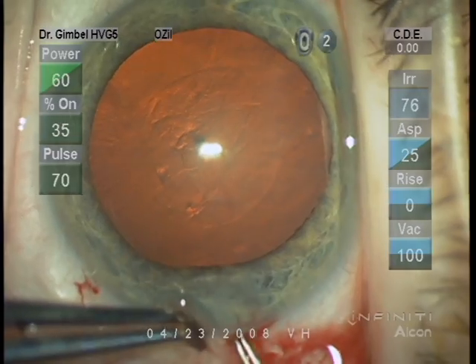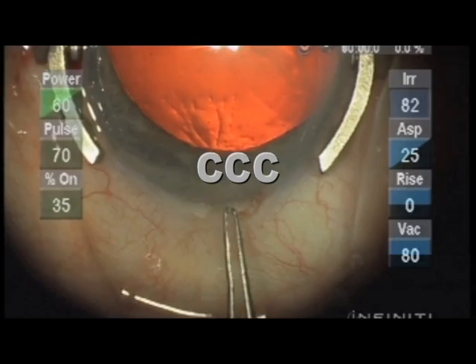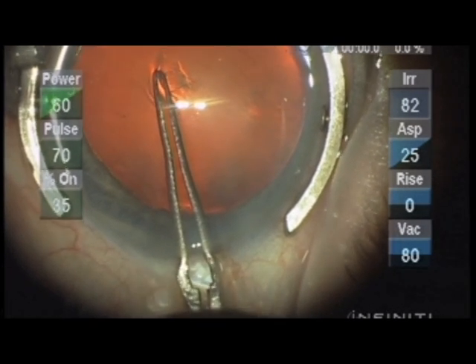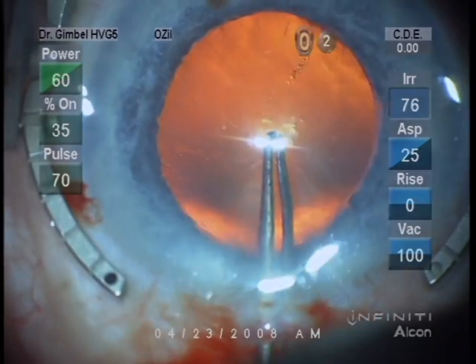This next clip shows the eye fixed with the fine Thornton ring. You can see the puncture with the capsulorhexis forceps. A little push ahead creates a triangle with the vertical tear in the capsule that's easily grasped with the capsulorhexis forceps. A radial tear perpendicular to the incision can be hard to grasp the edge of the capsulorhexis.